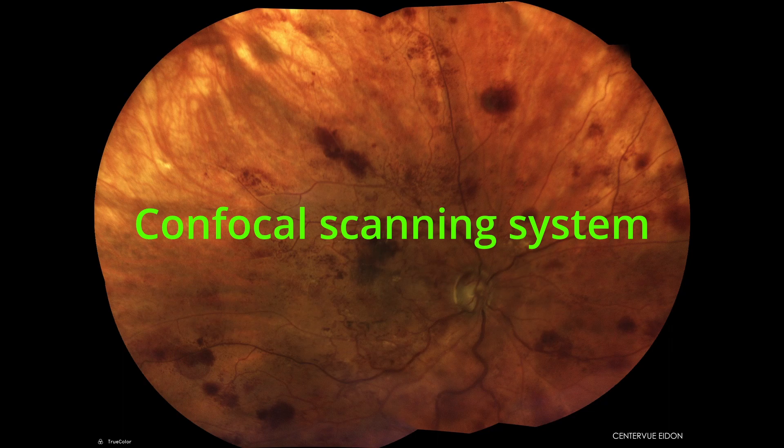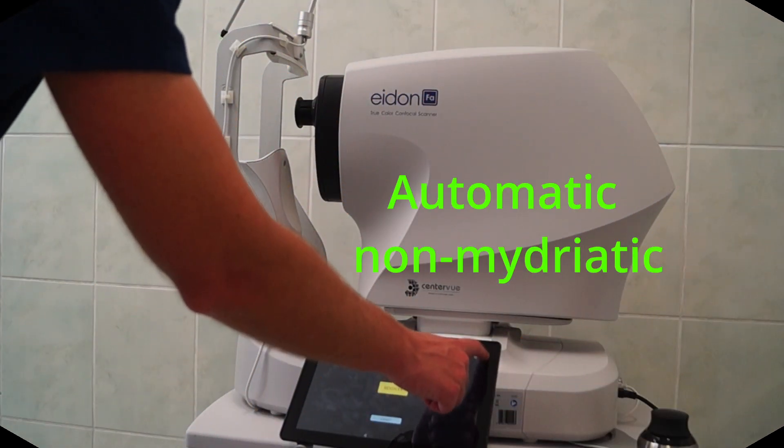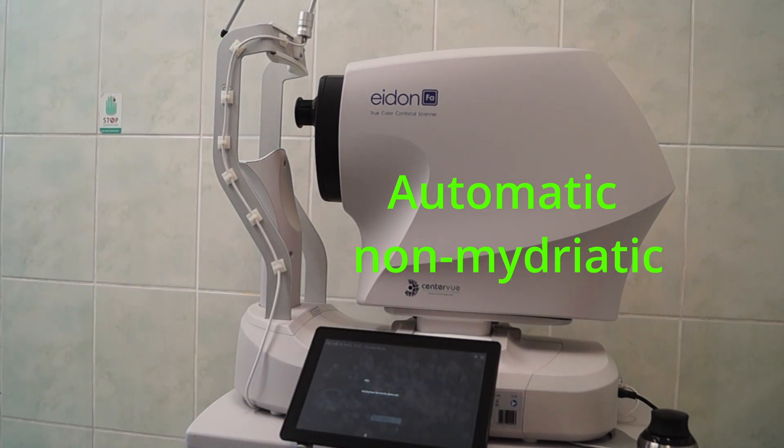This is a patient with vitreous hemorrhage — the inferior parts are slightly darker than the superior parts — and it's astounding to still get a nice image with vitreous hemorrhage. The best thing about Adon is that it's automatic. That means anybody who knows how to use a tablet can use it — actually, the patient can use it themselves.